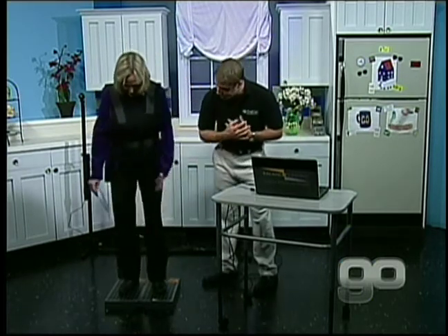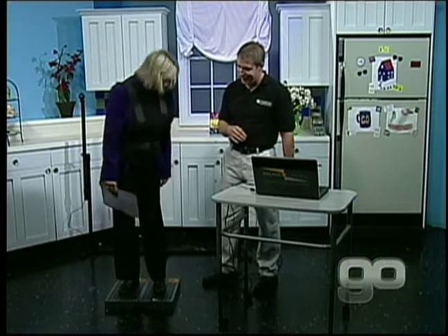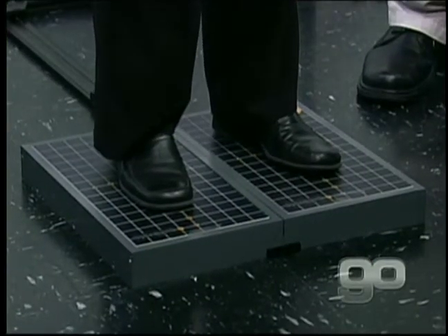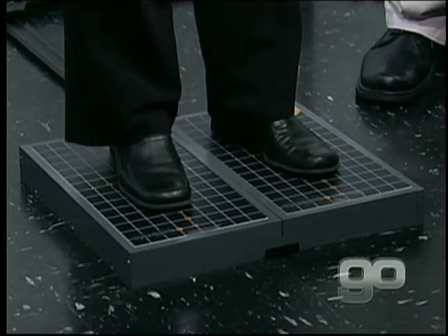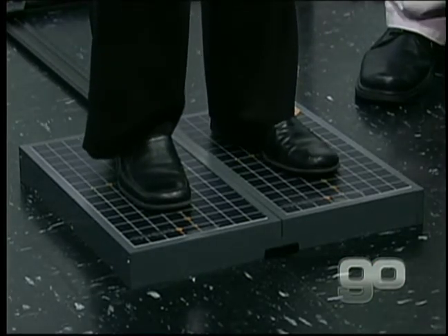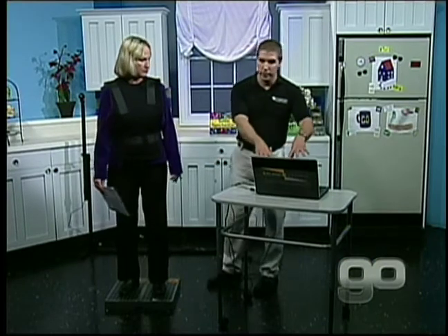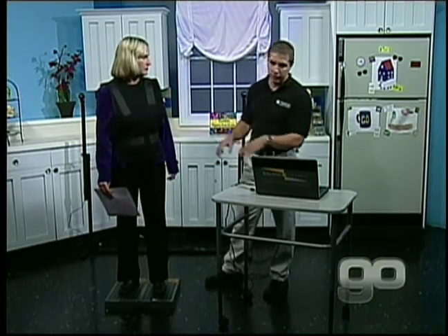Okay, and I've got my feet on these. It looks kind of like a bathroom scale. It does. Have you heard of the Wii Fit? Yeah. This is very similar to that. It can tell what position your body is in, how you're putting your weight on each foot, forward and backwards. Now, the computer takes all the information from the foot plate and the cameras and puts it in here. After we do a number of tests, it will tell us if you're a fall risk or you have really good balance. Okay, well, you got some tests here that you need me to do?